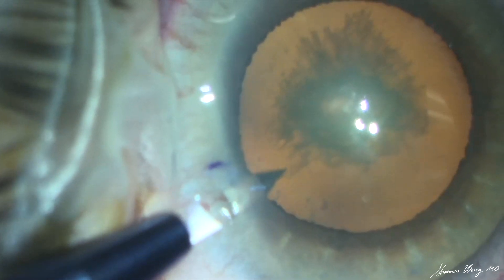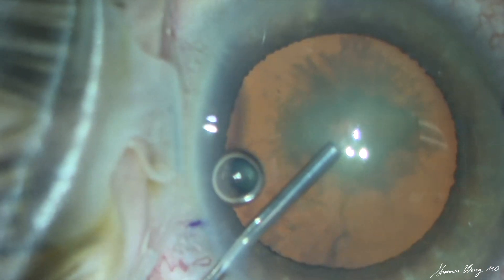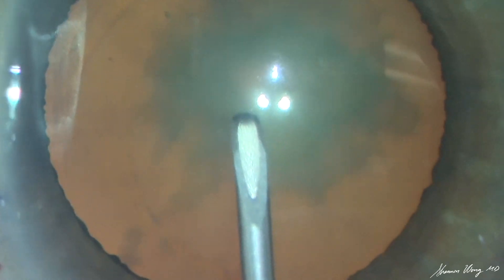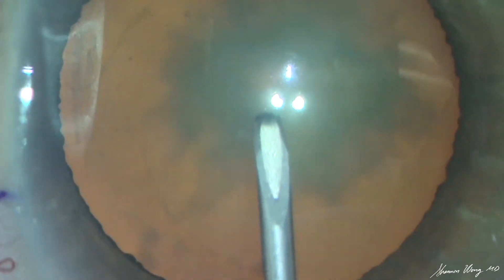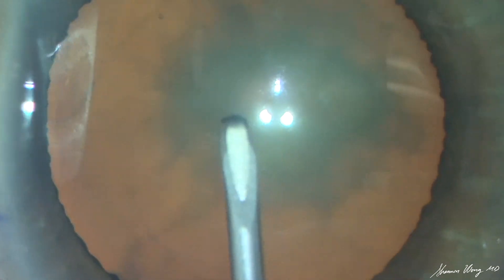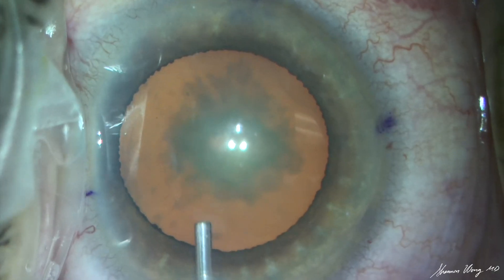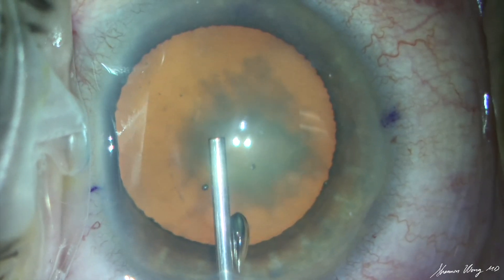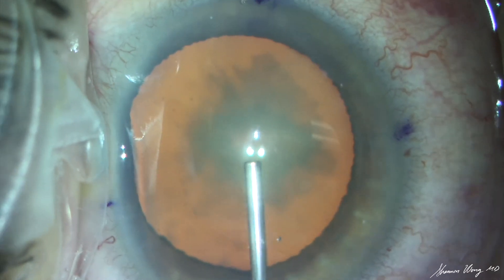The plan is to remove the cataract and place a PanOptix Toric lens. Initially, we fill the anterior chamber with OcuCoat and begin our usual capsulorrhexis with a 25-gauge cystotome. When we attempt to pierce the anterior capsule, there is increased laxity noted. We then use EndoCoat to fill the anterior chamber again.